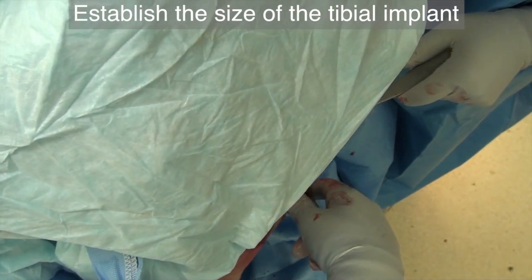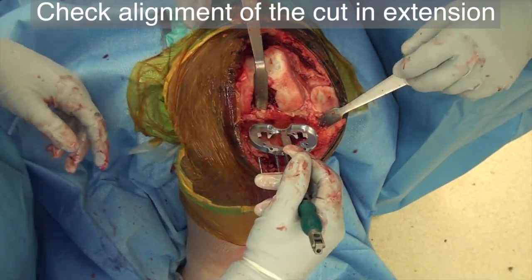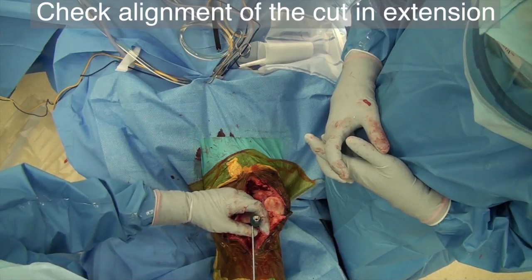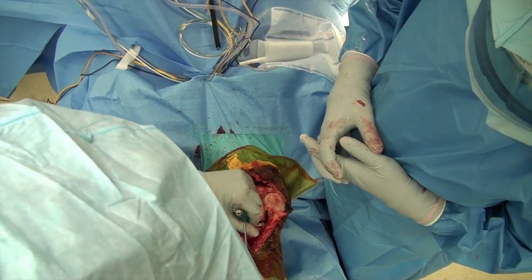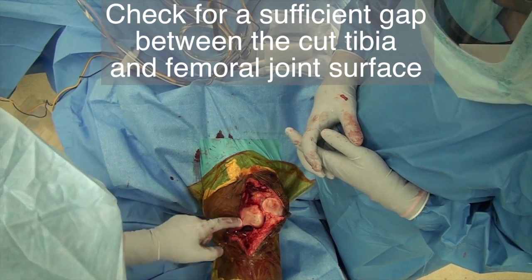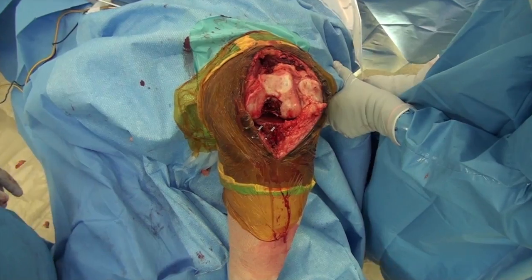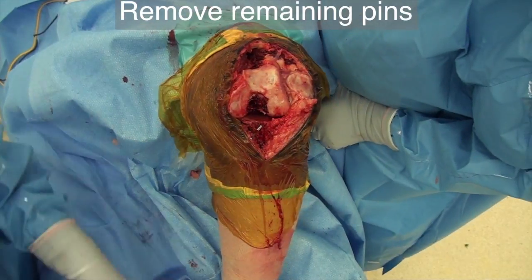Measure the size of the tibial base plate. Remove all the retractors and extend the knee to check the tibial cut. With the knee in extension, insert the alignment rod — it should point to the second metatarsal bone. Remove the tibial spacer and check the gap between the cut tibia and the femoral joint surface; it should be approximately one centimeter. If it's less, then you need to recut the tibial plateau. If the gap is sufficient, you can remove the remaining pins. That completes the tibial cut.